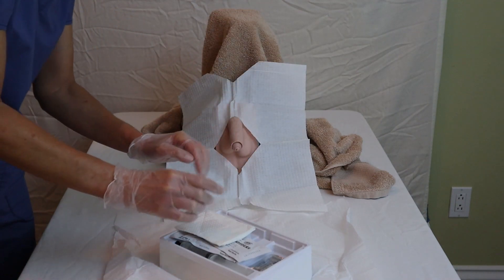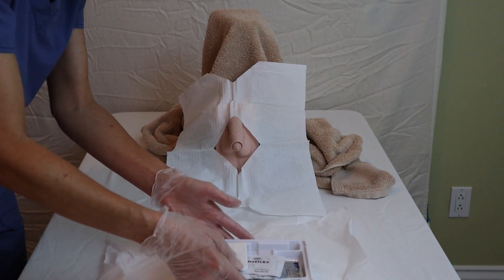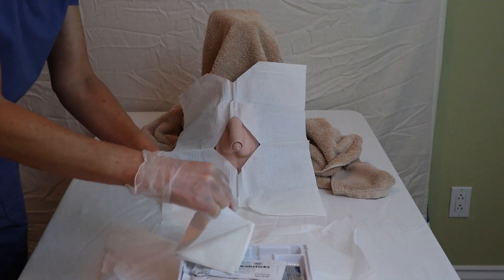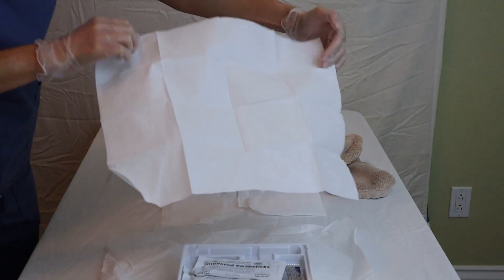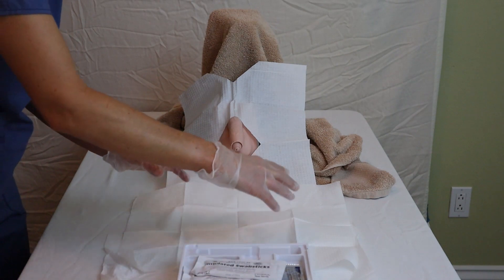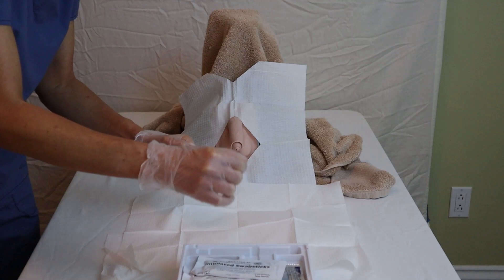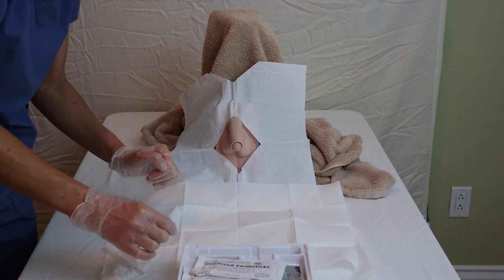Shiny side always goes down. My hands are sterile — I can rearrange my tray now. I'll move this away a bit and then use the other towel to extend my sterile field, being careful not to touch the bed or anything else. Now I have a nice working lane here and I don't have to worry about the catheter getting pulled or anything else getting in the way and becoming contaminated.